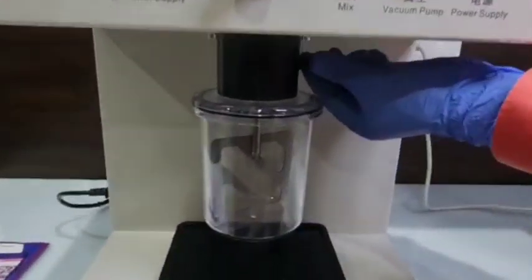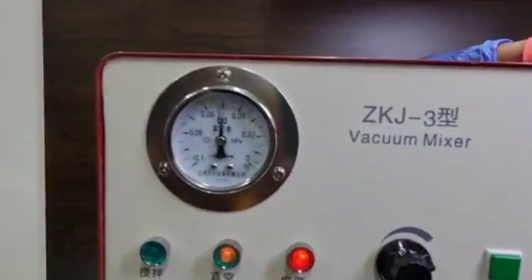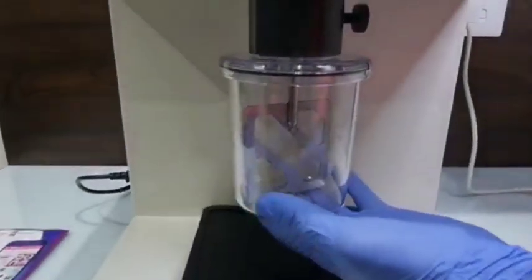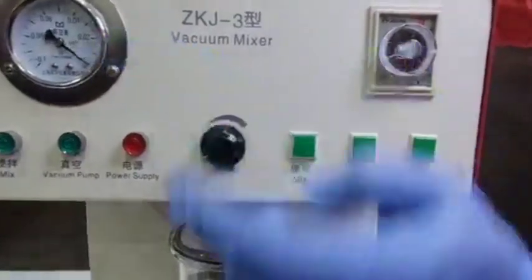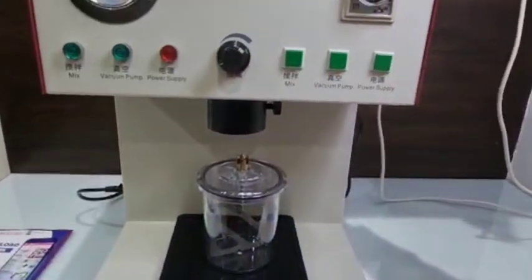This vacuum mixer is used for mixing and vibrating investment materials and molded materials. The mixing process is done in the vacuum state. When the vacuum will be released, the jar will automatically come down and be released.